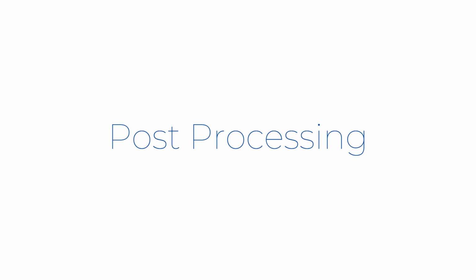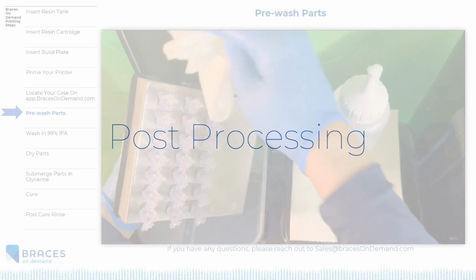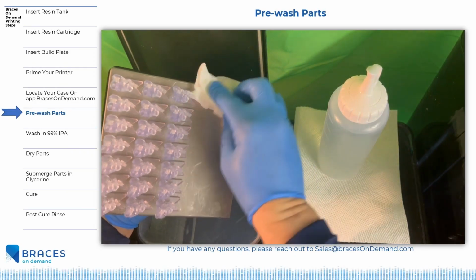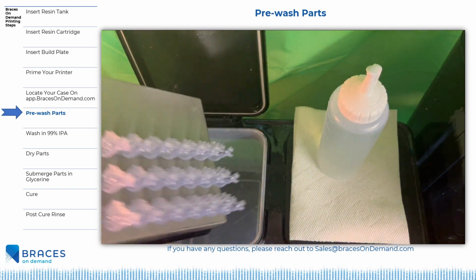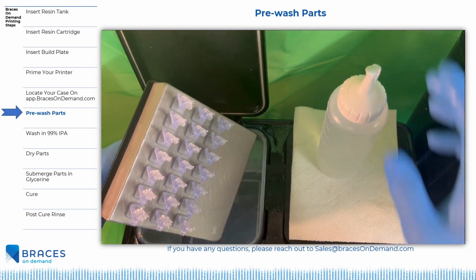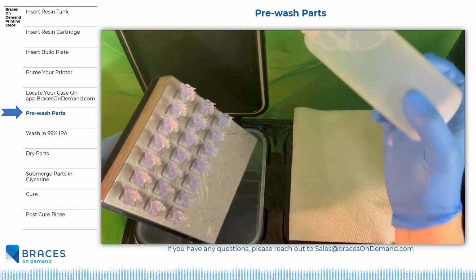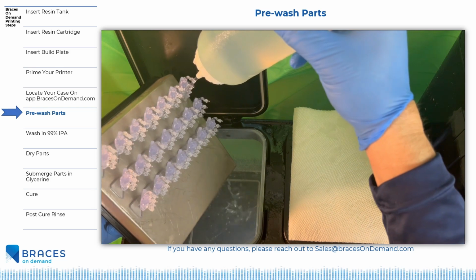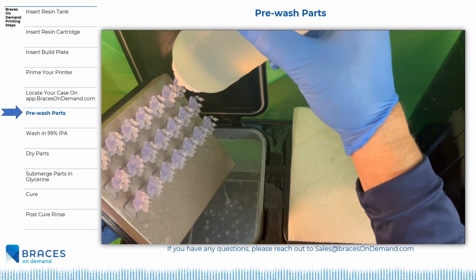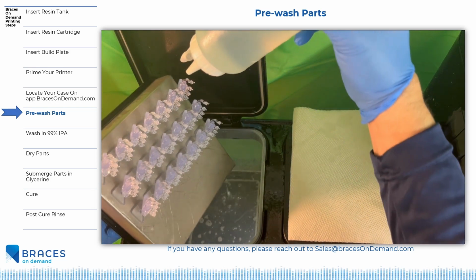After your print has completed, remove the build plate and pre-wash your parts prior to placing them into your Form Wash. By washing off the majority of the excess resin, pre-washing your parts greatly extends the life of your IPA in your Form Wash. This step is well worth the time. Not only does it result in cleaner parts, but it makes our lives easier when we don't have to change the IPA in the Form Wash bucket as often.